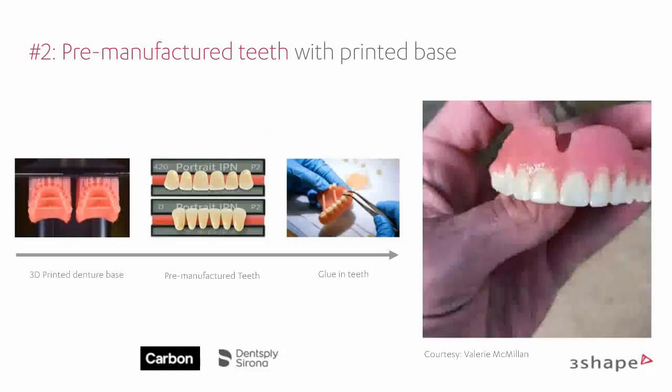But basically, this is a very strong base. And I was almost hyped about this new 3D printed denture because you're kind of combining at least some of the good parts. So inexpensive 3D printed bases with denture teeth, and it means that material cost here is around, I believe, $65, and still the main cost is on the denture teeth.